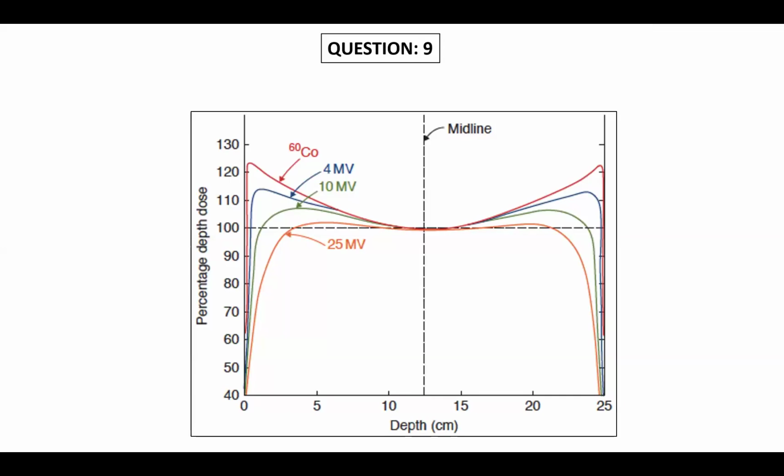Clinically, this is showing the lateral tissue effect, sir. This graph represents the lateral tissue effect. Mainly when we use low energy beams, and only if we are using APPA, when the lateral separation is more for the patient. This will happen because the dose distribution will be maximum at the lateral levels, telling that the peripheral tissues receive more dose and in the central region the dose will be less, sir.